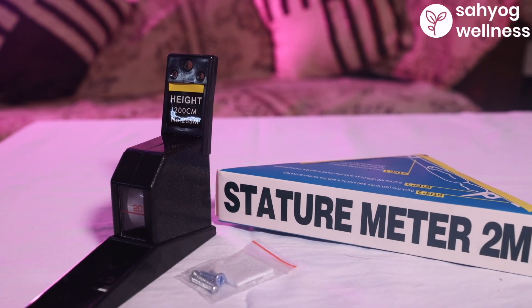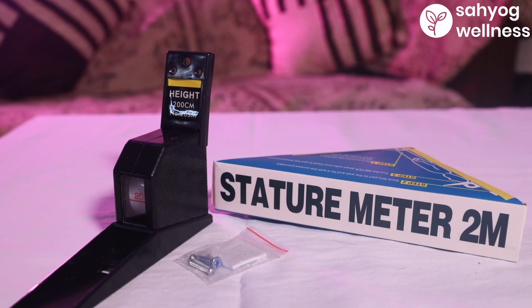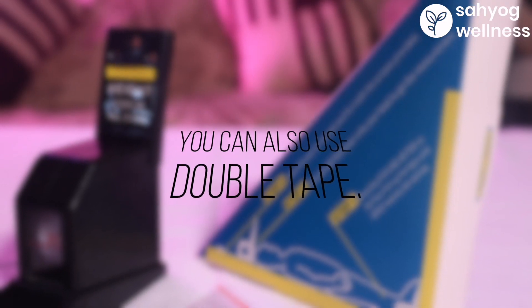After that, you can fix it permanently with the help of nails which are provided with the stature meter. You can also use double tape.